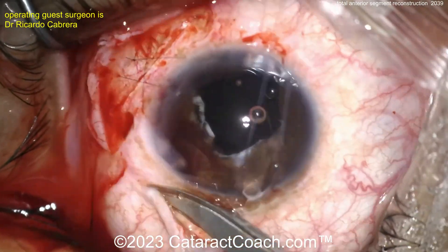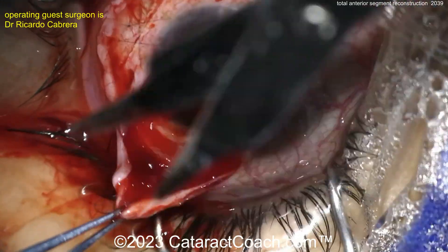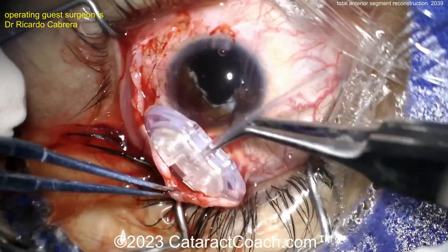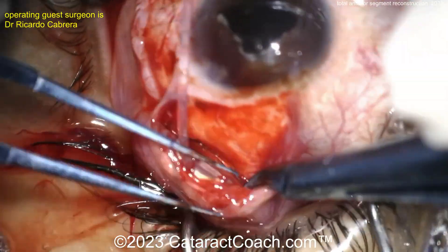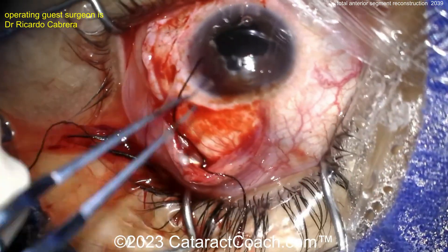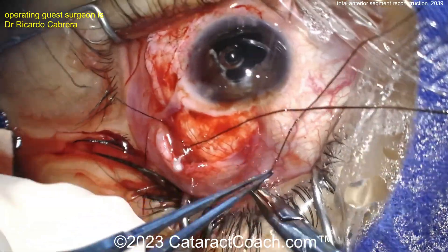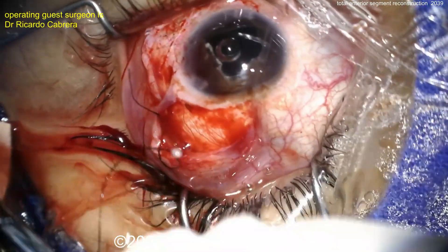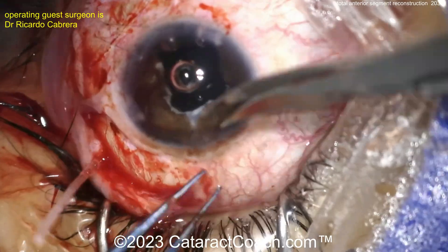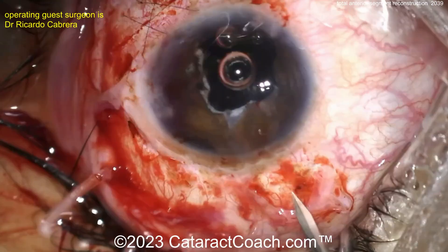Now let's see what we've got on the other side — maybe another incision. Another peritomy. A glaucoma valve — this patient also has high pressures and needs this seton placed. That's why there's another peritomy. They're located superiorly up under the eyelid — nicely placed. I like that the footplate of that valve is placed very far back, probably 10 millimeters from the limbus. That's super smart.